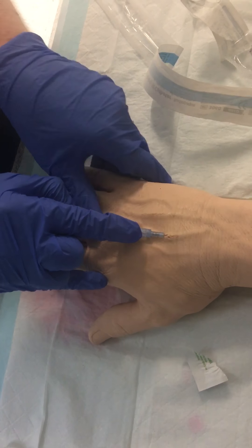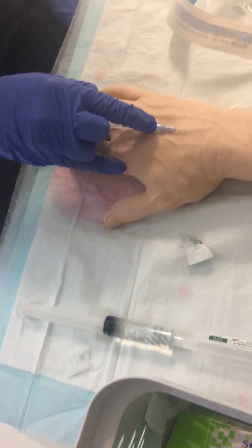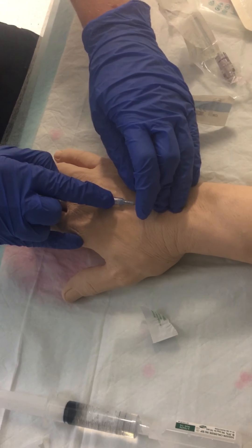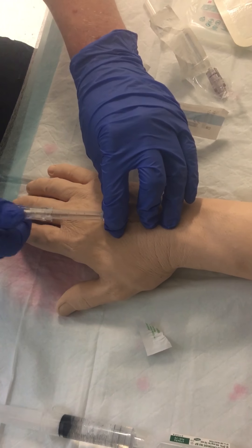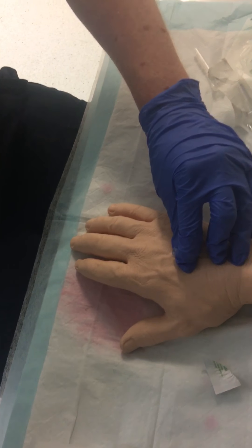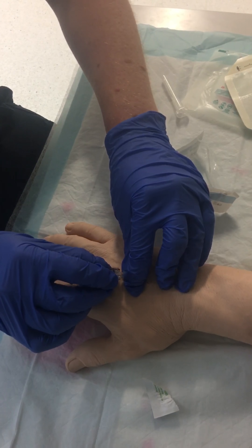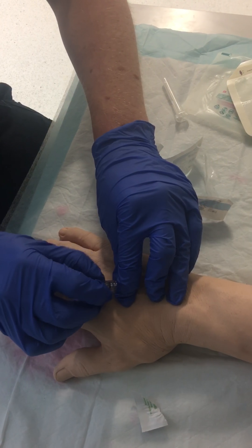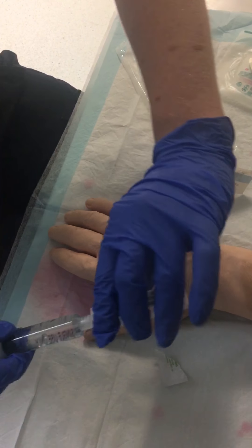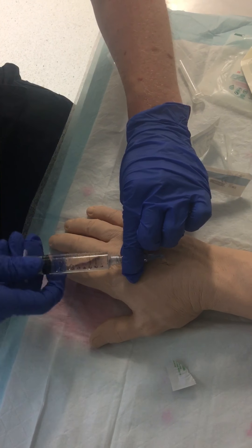When I hear a click, I also want to undo the tourniquet. Then I'm going to put two fingers to tamponade the vein so that it doesn't bleed. I'm going to hold and twist the needle off and pop it into the sharps container. Then I'm going to get the bung and screw that on, and then I can release the pressure. Now I'm going to flush the cannula to make sure that it's in properly.